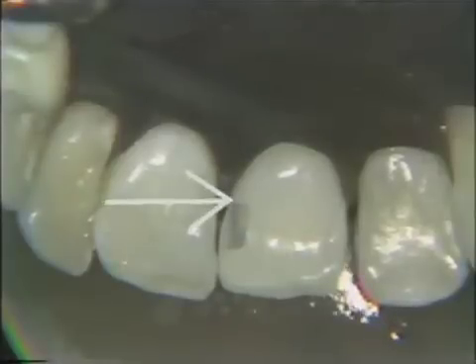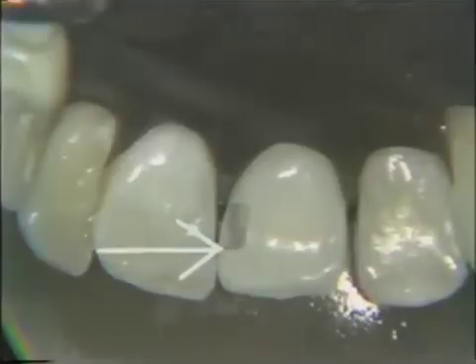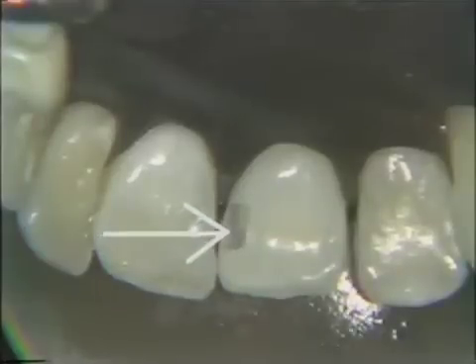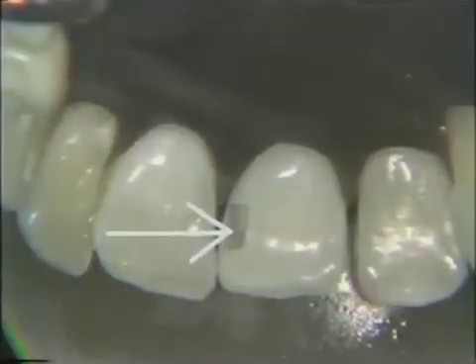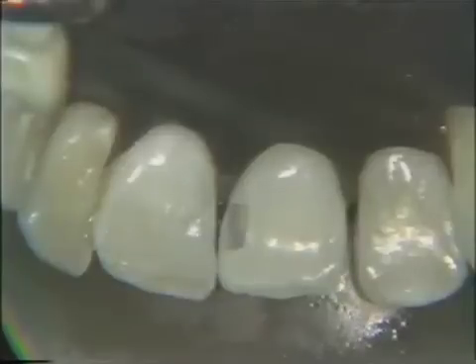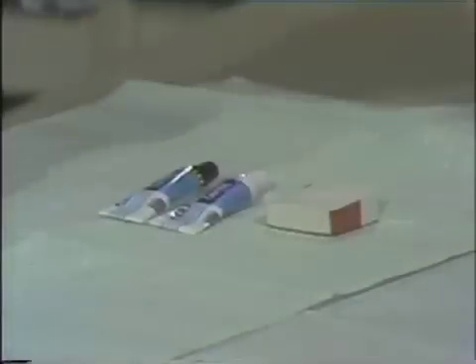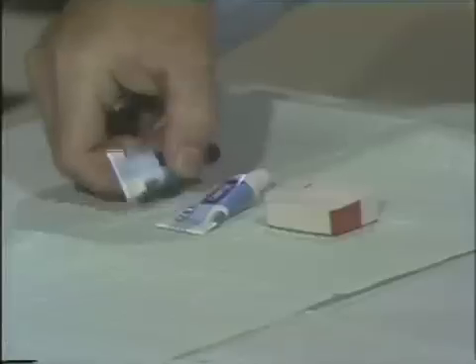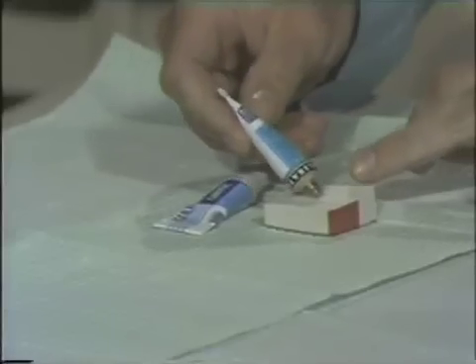Notice again now the cavo-surface margin of extreme importance, very smooth, coming at right angles, no bevels. And then out to the labial wall, how smooth this wall is. We cannot have a smooth finished preparation without starting with a smooth cavity preparation. This is, of course, one of the most important steps in our whole procedure. This preparation, as I say, relates to your number 2 that you have at your desk.